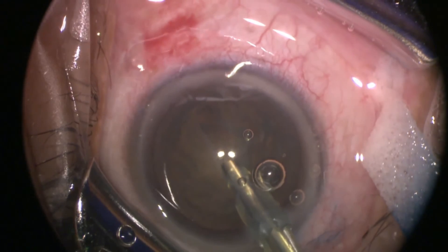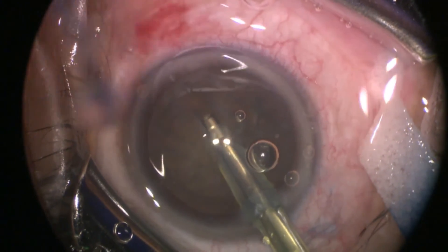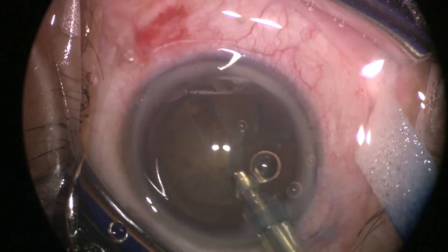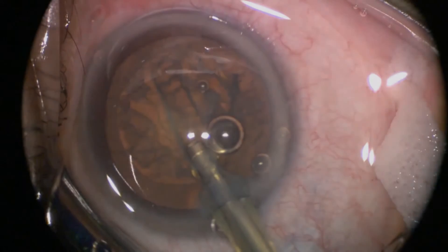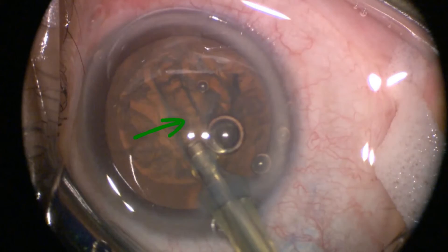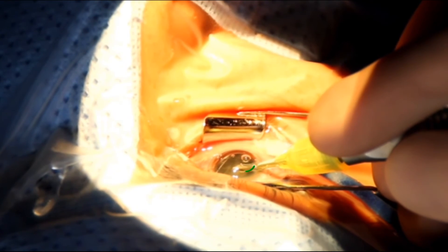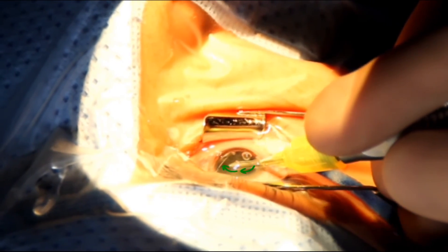Another thing to keep in mind is the architecture of your groove. The aim is to create a groove in concordance with the spherical nature of the lens. Your groove needs to be deep in the center and slightly shallower in the periphery, so the movement of your probe in each stroke should be from down and then back up again.